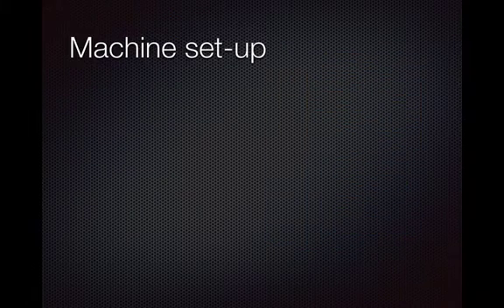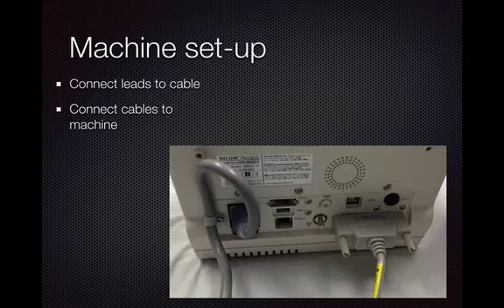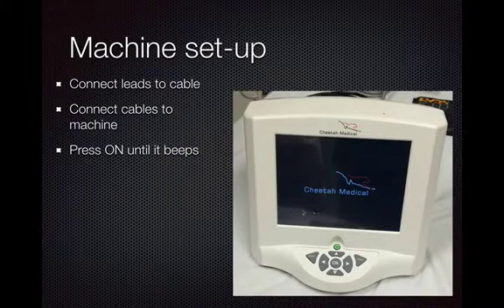So how do you set up the machine? Once you put the leads on, one pair of leads will have red heads like this, and the other ones will have clear or black. The red will go into this red receiver, and this one will go into the black receiver, and they'll combine to have a cable which you plug into the machine right here. The blood pressure cuff plugs into here, and once you have everything plugged in, you press this green button right here. Hold it until it beeps.